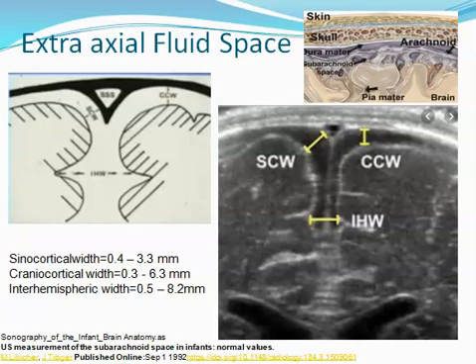For the assessment of the extraaxial fluid space, you take the width of the subarachnoid space, which is measured on the coronal views through the anterior fontanelle. For the evaluation of the subarachnoid space, you will have to use a good amount of gel over the anterior fontanelle.